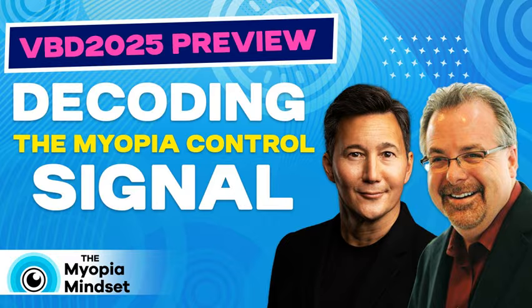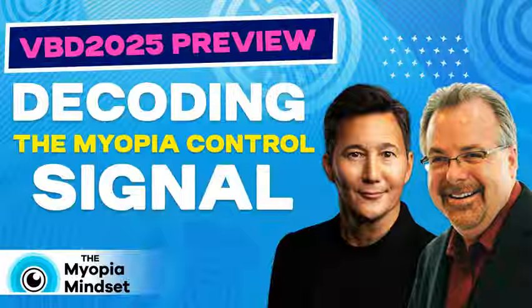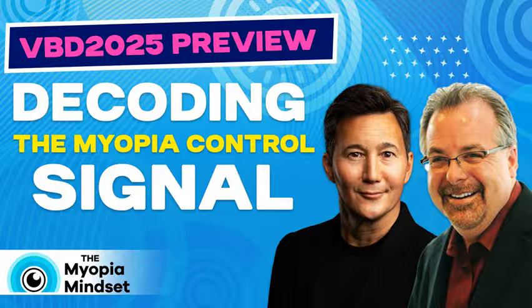And axial length measurements have been a critical tool in understanding these early adaptations to myopia control. Are we getting the appropriate signal for that individual child? And that we have to pick up with very conscientious, very deliberate axial length measurements.